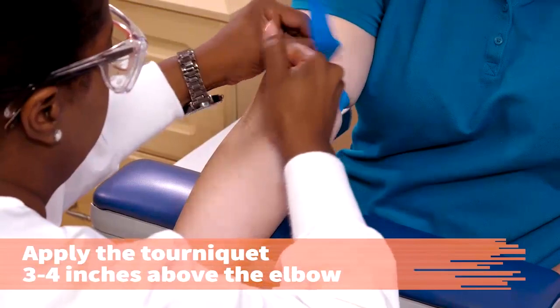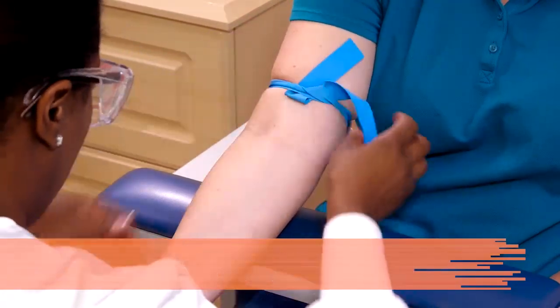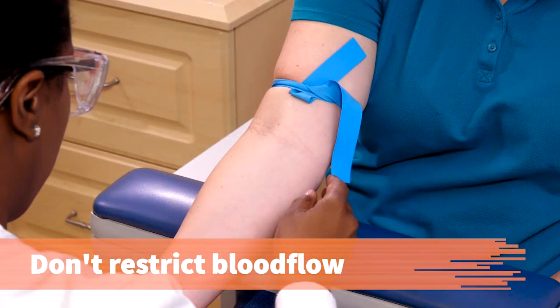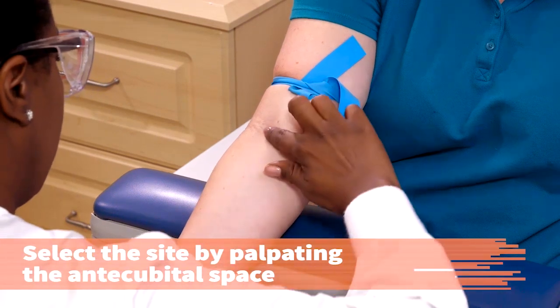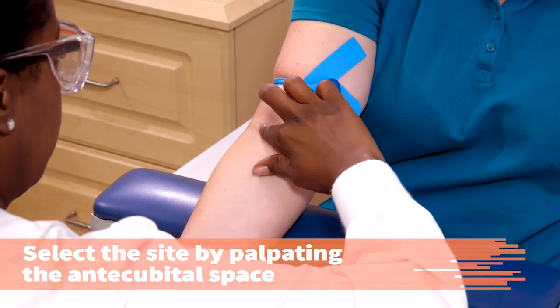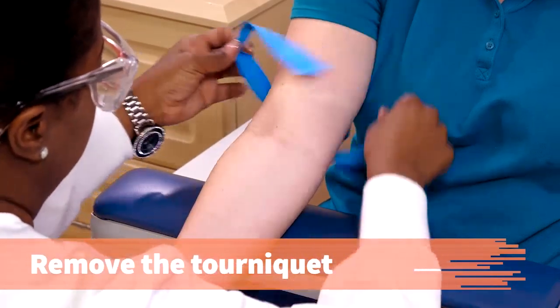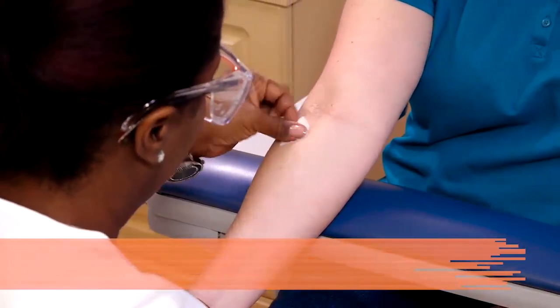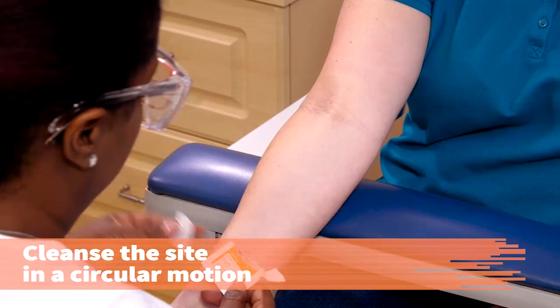Apply the tourniquet around the patient's arm three to four inches above the elbow. The tourniquet should never be tied so tightly that it restricts blood flow into the artery. The tourniquet should remain in place no longer than 60 seconds. Select the venipuncture site by palpating the antecubital space. Remove the tourniquet and cleanse the site, starting in the center of the area and working outward in a circular pattern with the alcohol pad.